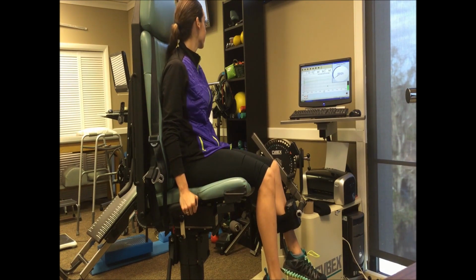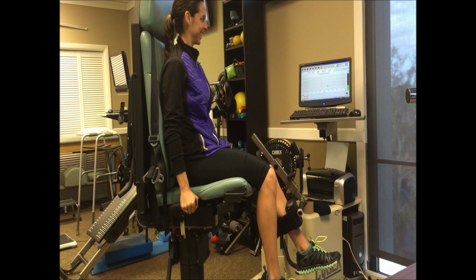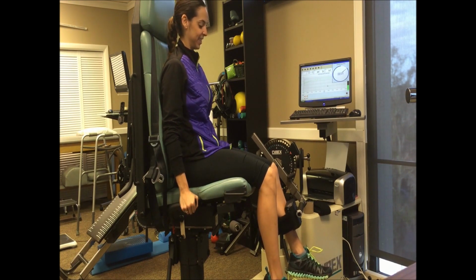Now they should be showing you signs of exertion. They should be making faces, turning red, grunting. If they're just smiling at you or making no expression, you need to motivate them.